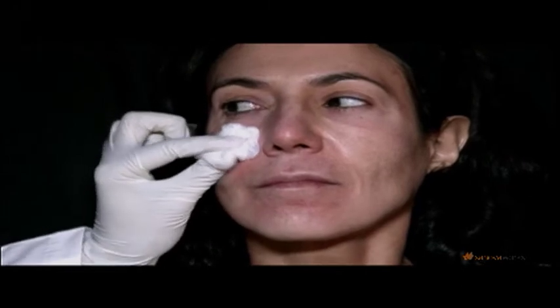She's now got more of a cheek on that side. She's got a shadow on her untreated side. Can you all see that? So at this point, what I've put in is just 0.4 of a cc, 0.5 actually, and look at the difference we've got already.